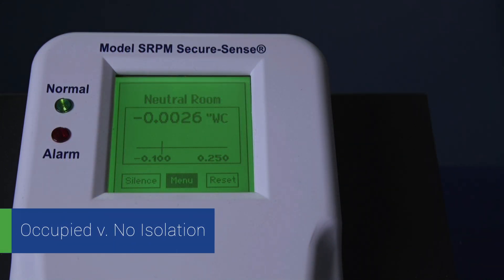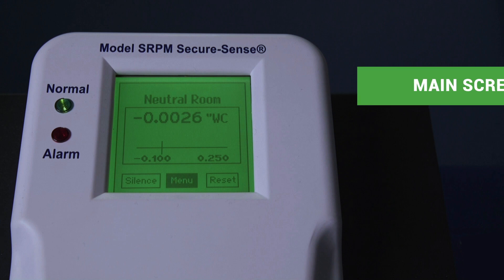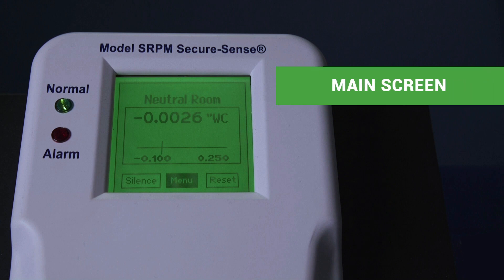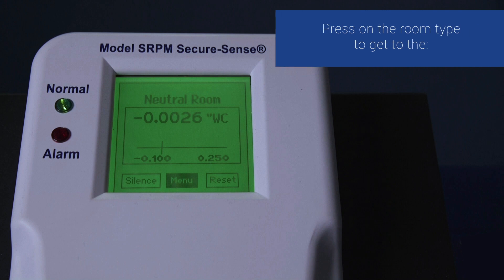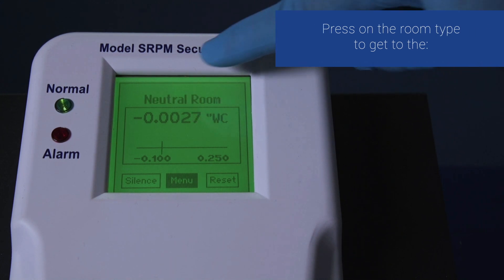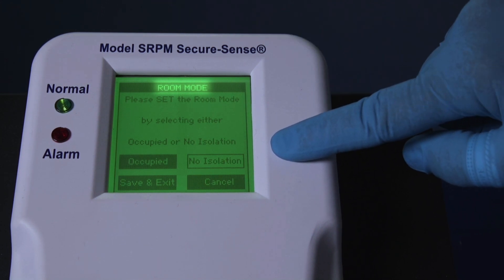Occupied versus no isolation: This basically determines if the room is being used or not. Press on the kind of room pressure that is displayed on the main menu — in this example it is neutral. This is the room mode screen where you can choose occupied or no isolation by simply pressing either word.